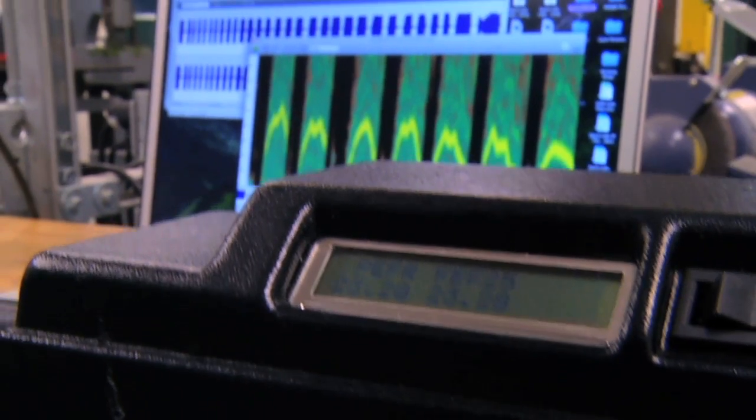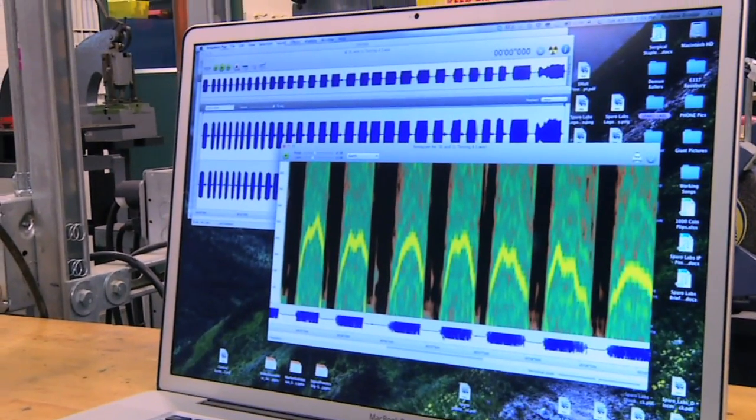We had a series of meetings basically just reviewing all the steps that we do in order to do a lung function test, and how to do it accurately, and how to understand the results of that test so that you can say something is abnormal or something is normal. After that point, they came up with this prototype of a low-cost spirometer that was really quite innovative.